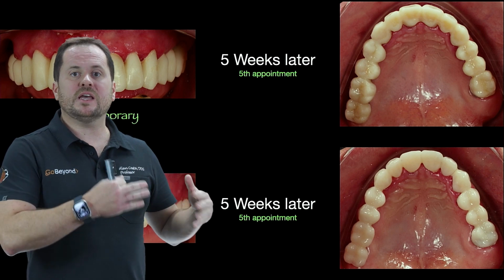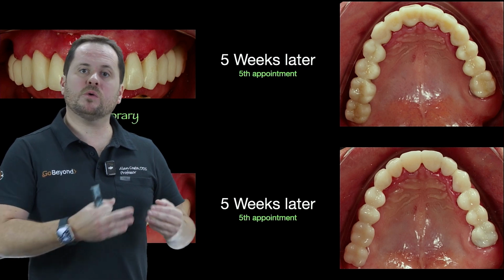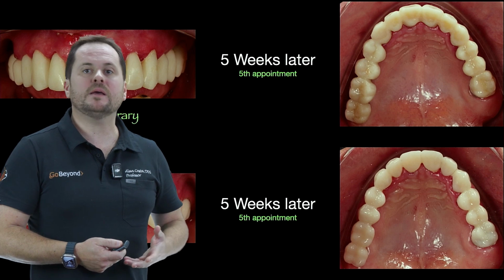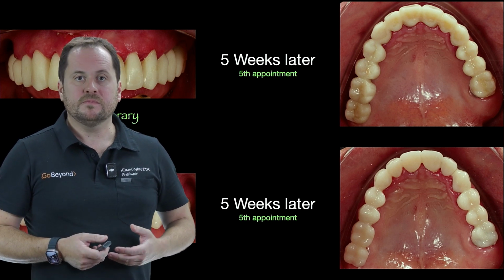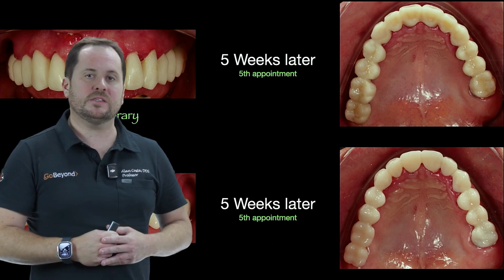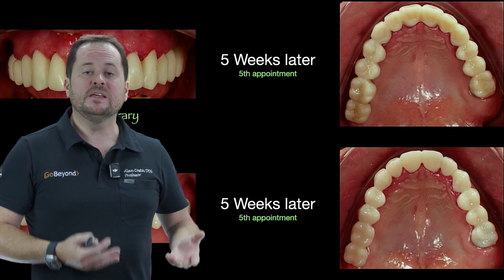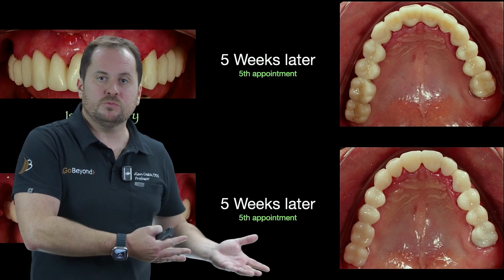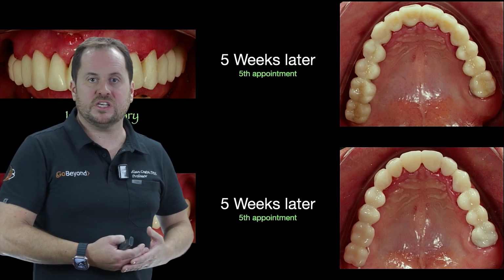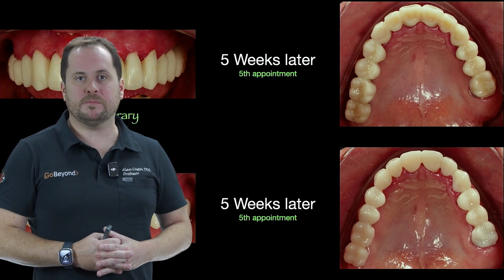So you are studying the shape in a meticulous manner while calmly allowing the tissue to breathe. And you are achieving agility and producing these temporaries at a much lower cost and much faster, and precisely with great care. Imagine if this patient ends up breaking these temporary prostheses that you placed on the patient. What will happen? You just call your lab and say, hey, please print another set. Without the improvements yet, I'm saying, a print of a new set of provisionals for you to make an adjustment. Because that's the great benefit, folks, of working with digital.